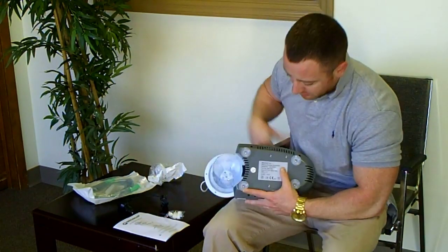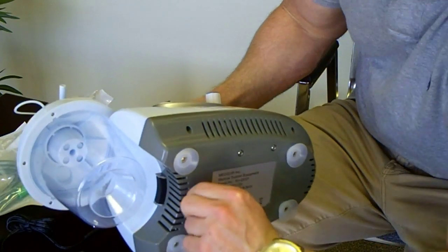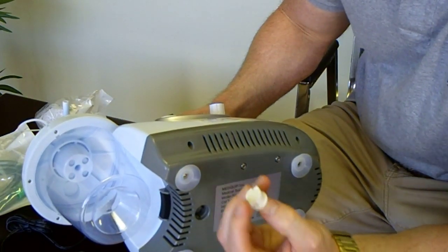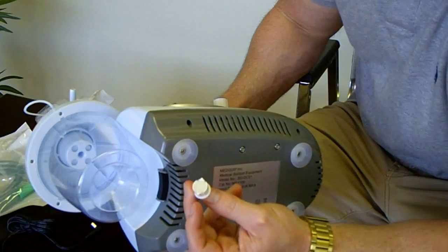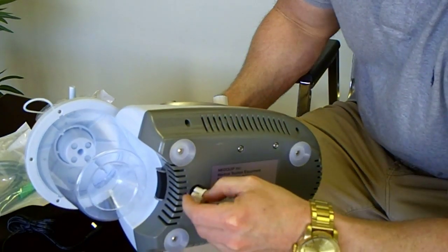The last thing on the bottom of this is a filter. Check it every 2 or 3 months. You'll see it'll get dusty. You can just knock the dust off of it. If you have to, you can replace it. If you don't have a replacement, call your provider. They can mail you one.